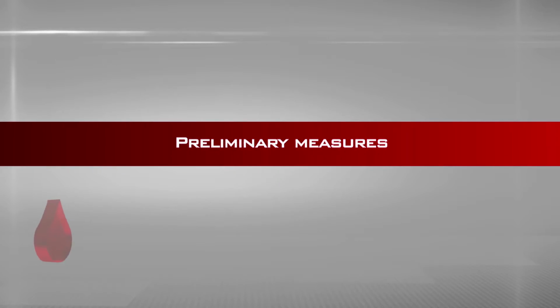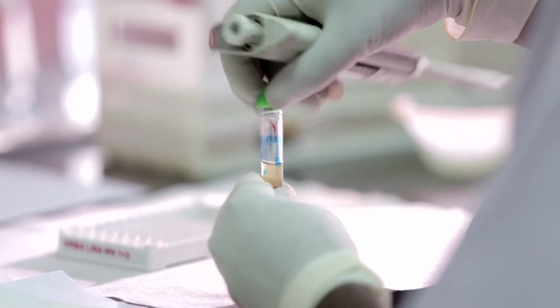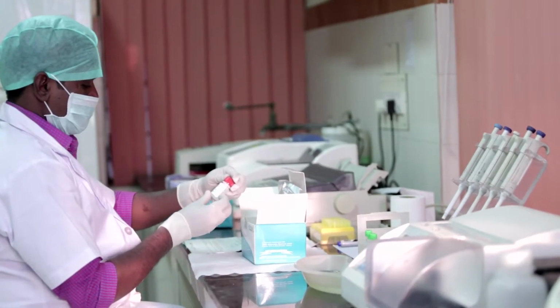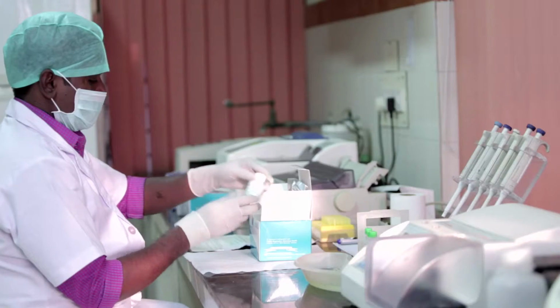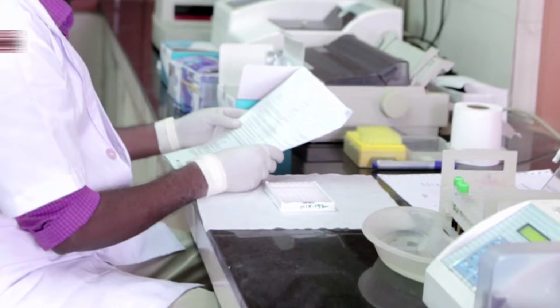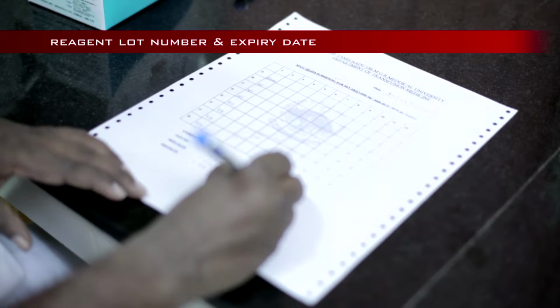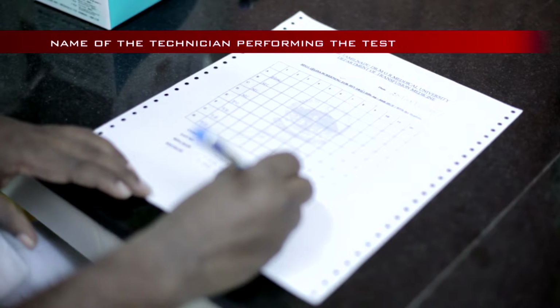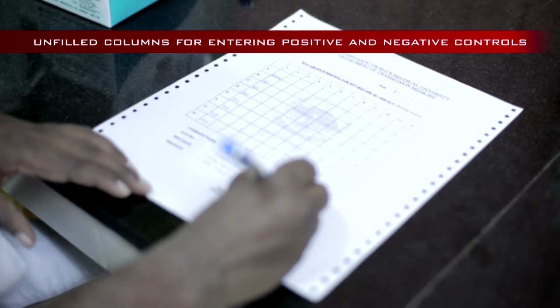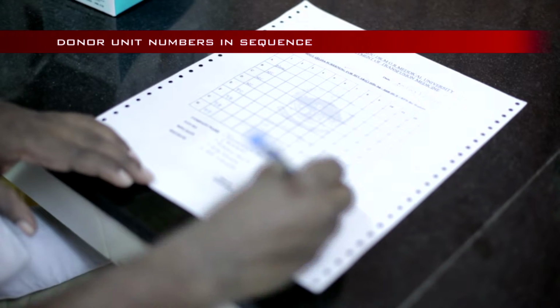Preliminary measures. Sample identification is done by cross-verifying donated blood unit numbers with corresponding pilot tubes containing serum. Check the reagent kits for lot numbers, expiry date and any visible abnormal changes. Prepare worksheet with particulars such as name of the test, date of testing, reagent lot number and expiry date, name of the technician performing the test, signature of officer in charge, and unfilled columns for entering positive and negative controls, and donor unit numbers in sequence.